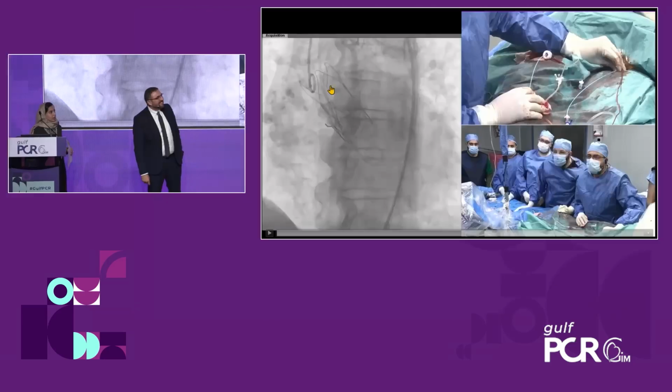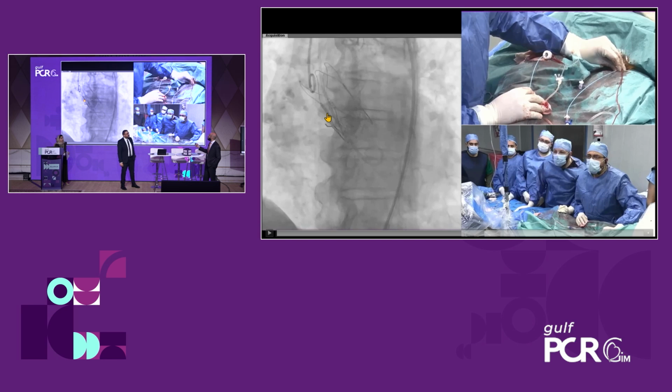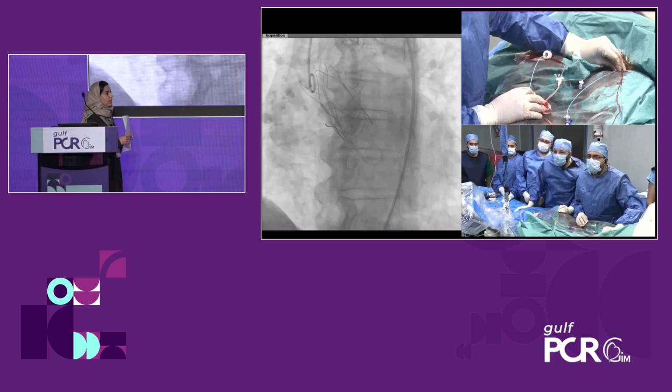So I'm not sure. Yeah, you can see. The posts here are aligned in a way that they're all parallel. And we're going to show images of where it's not. Even if you have a good gradient and you see those, you definitely want to post-dilate. So just one thing to kind of point out.